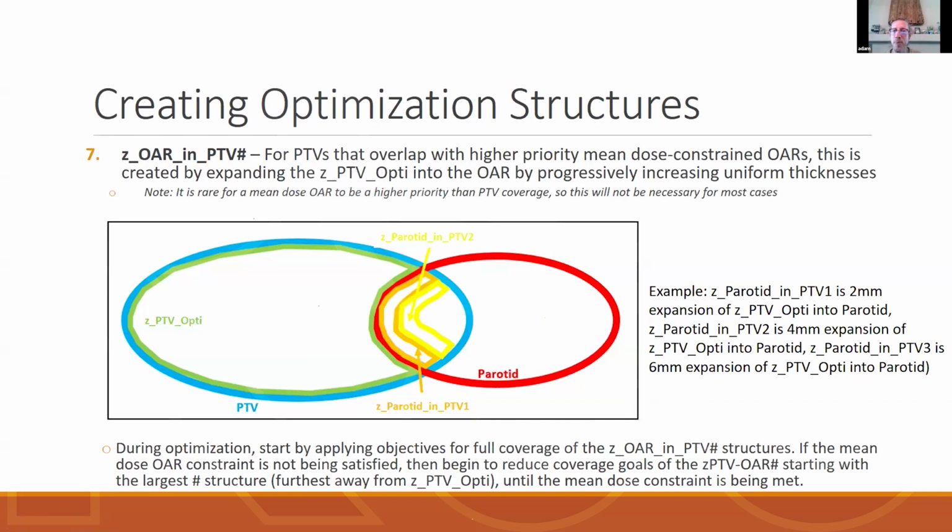If you could pause just one more time, Brendan. Again, this is all great information. Brendan's talked about all this dose falloff. Let's say we're at a parotid, and Brendan's already discussed that you've got a maximum of 10% per millimeter falloff on a small organ at risk. Once you've achieved that, you get this nice sharp dip in your 50% line that's 5 millimeters away, right? 10% per millimeter, 50% at 5 millimeters away.